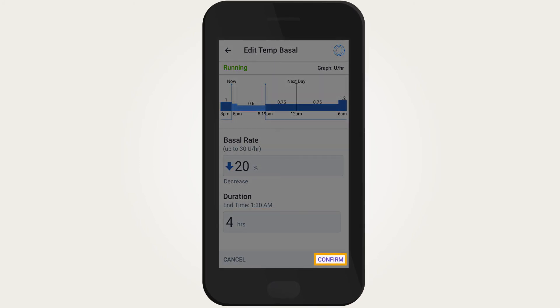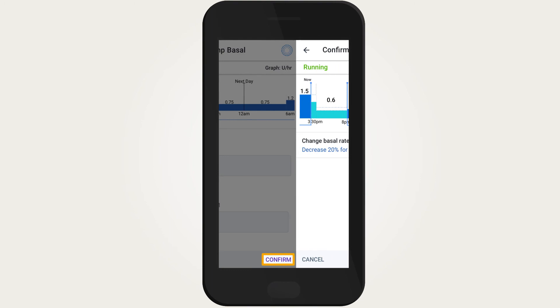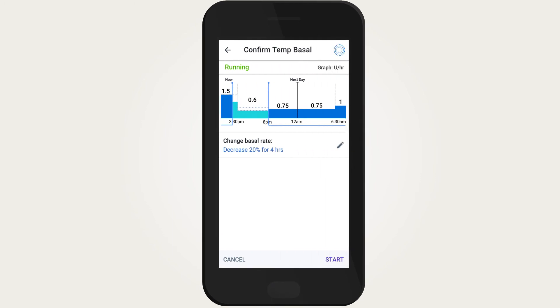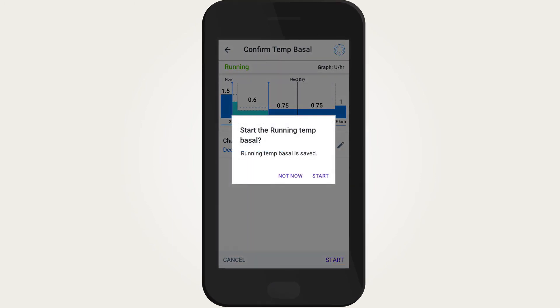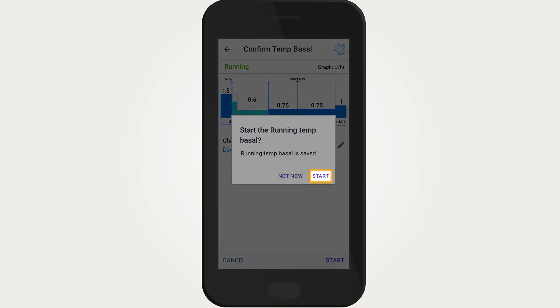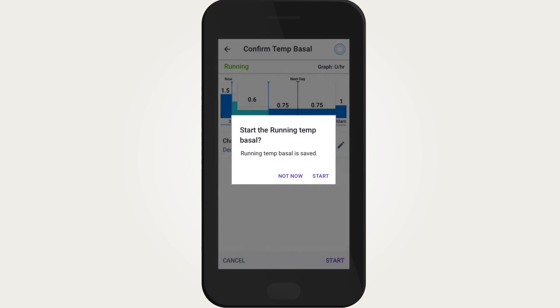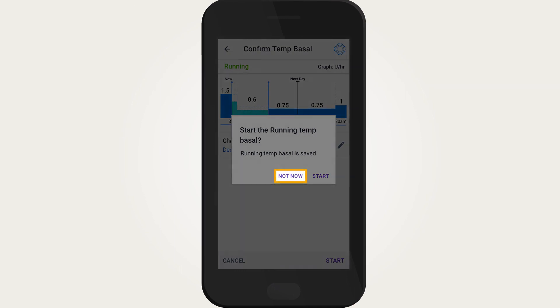Tap Confirm to continue. Review the temp basal details. Tap Start. If you would like to start the temp basal preset now, tap Start. If not, tap Not Now.